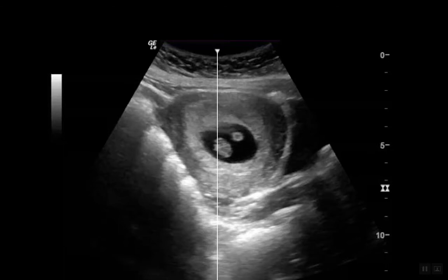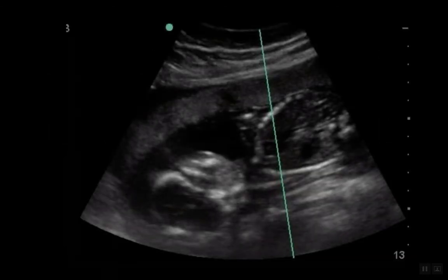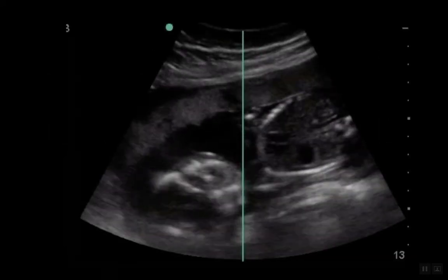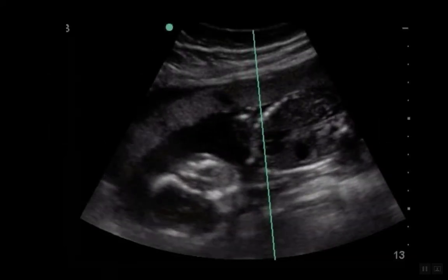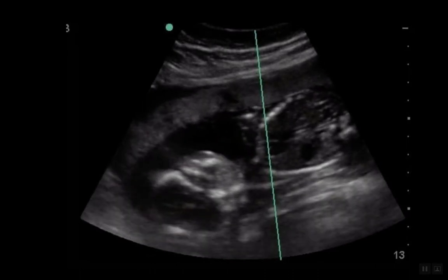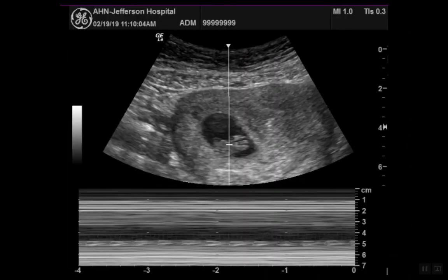You'll get a cursor — a line — and you want to move the line over the heart, arranging it to the point where you're able to measure the motion of the heart. After you do this, you'll get a tracing, as you can see below, where the peaks and troughs correspond to the heart rate of the fetus.